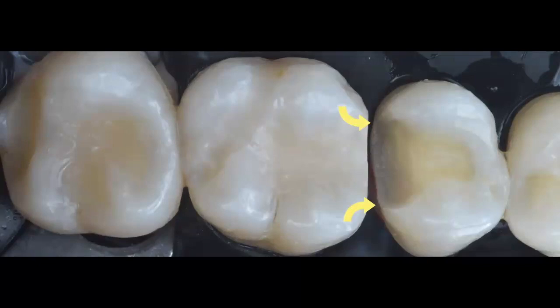When you think about this, if you were to restore this distal box using, let's say, a Garrison ring, depending on the Garrison ring that you choose, the band may end up impinging in the area where my yellow arrows are located. This will definitely deform the anatomy of your proximal contact. That is most likely what happened with the previous dentist when they restored this case. They did not select the correct band, and because of that, the band impinged or deformed that sectional matrix and allowed for that wider buccal embrasure.